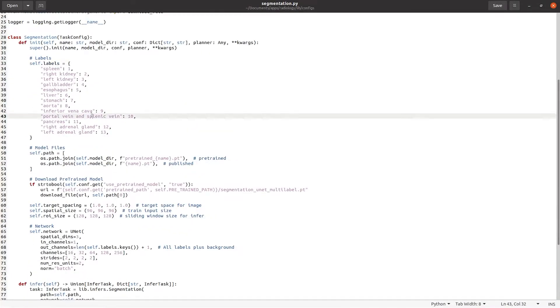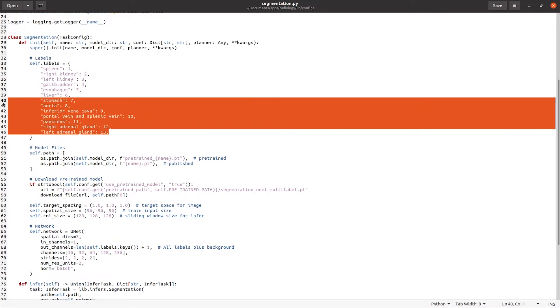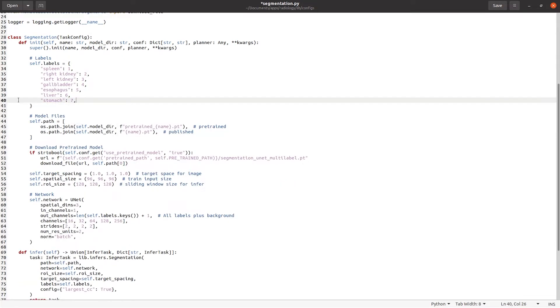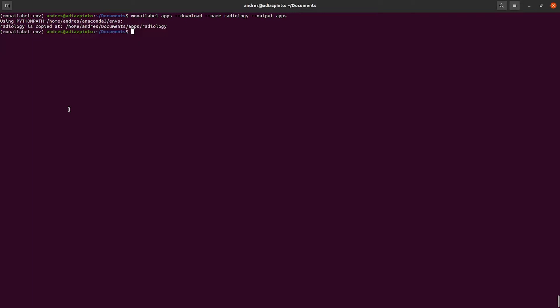More details of the MONAI label setup can be found in the MONAI label installation and training from scratch videos. For this demo, I'm using the Spleen dataset from the Medical Segmentation Decathlon. You can easily download this dataset from the website.